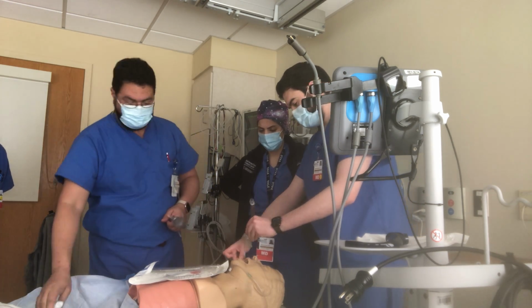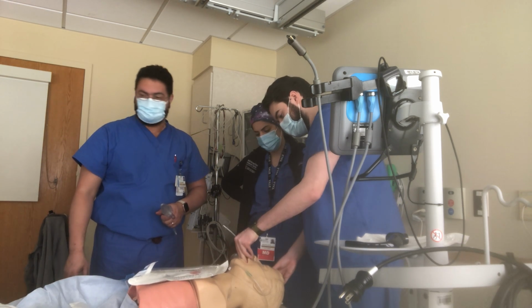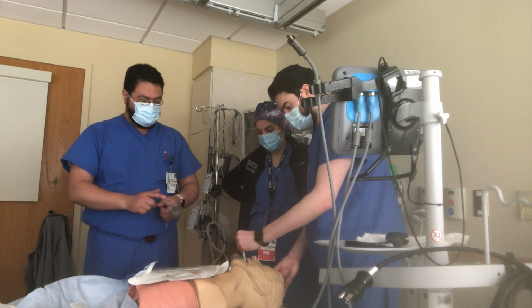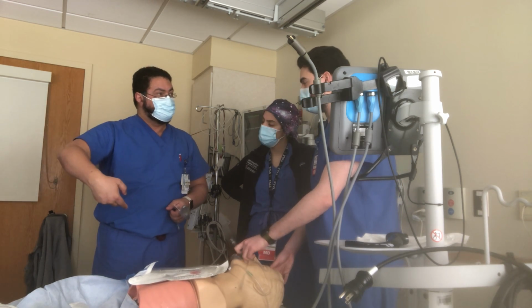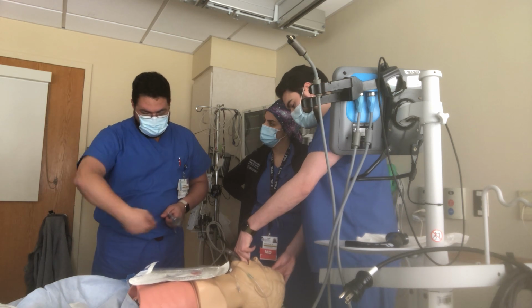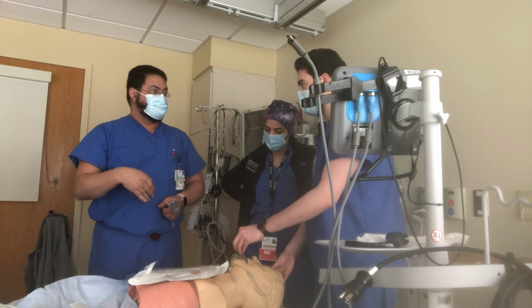This is not in the difficult airway algorithm, by the way. I'm just showing it to him because he's an anesthesiologist. I don't like it in the difficult airway algorithm. This is better, right? So he puts it, and the fingers are there to push against the hard palate. You're literally using these two fingers to push against the hard palate as you're putting it inside, so it goes above the tongue, it doesn't push the tongue, right?